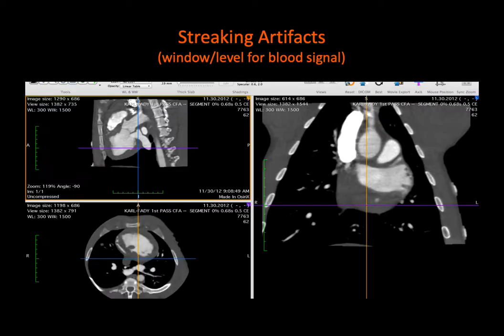So to show these effects, if you look at this picture, the intensity here in the myocardium appears to be homogeneous. Right? And this is a function of how we visualized it. We're really trying to highlight the difference between the blood volume, or the blood intensity, and the myocardium. Not any subtle differences in the myocardium itself, but just the fact that there's a bright area and a gray value. Right? Or this has basically three tones. It has the bright value, the gray value, and air.